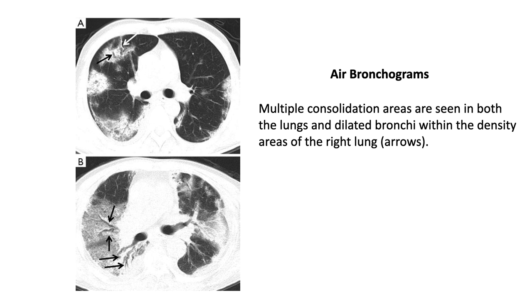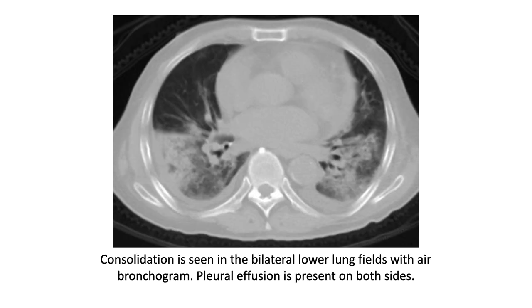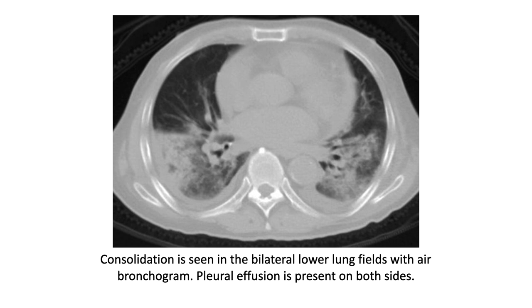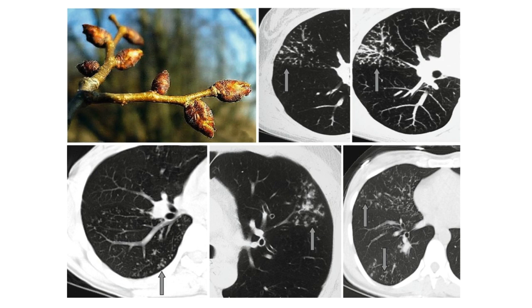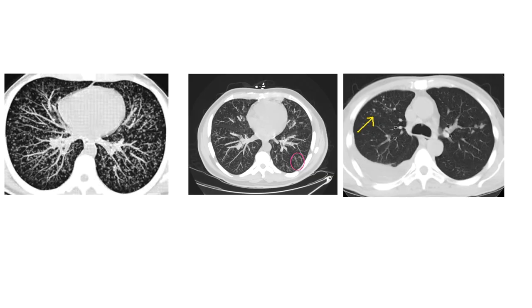Consolidation is a dense opacification with air bronchogram — multiple consolidation areas in both lungs with dilated bronchi within the consolidation are seen. There is also bilateral consolidation with a very thin rim of parapneumonic effusion. Coming to tree-in-bud appearance — CT shows it very clearly. The first image is clearly typical of tree-in-bud appearance, though the middle and right images are more subtle.